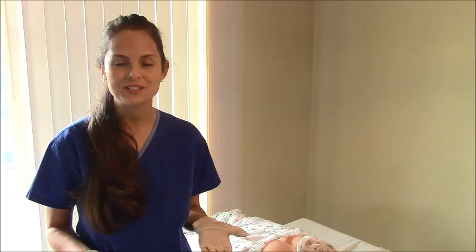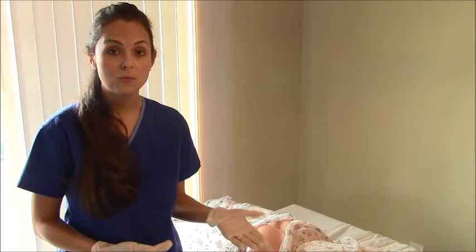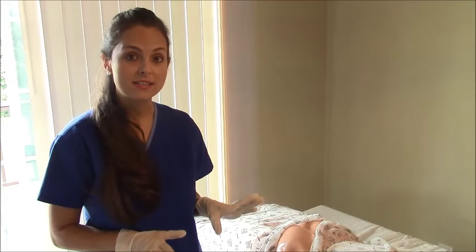First, what you want to do is explain the procedure to the patient, do hand hygiene, and gather your supplies. Here we have Ms. Smith. We have her in the prone position, which is on her belly, because this is the position you want to give your medications in whenever you're giving an injection in the dorsogluteal muscle.